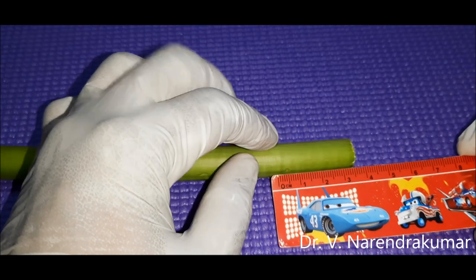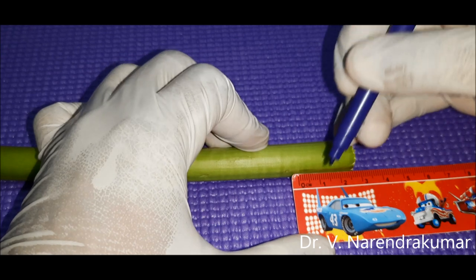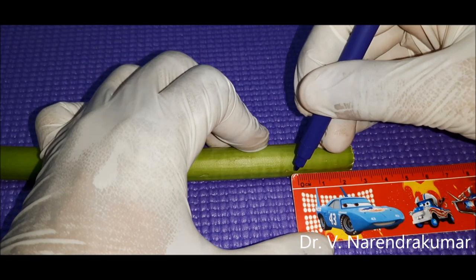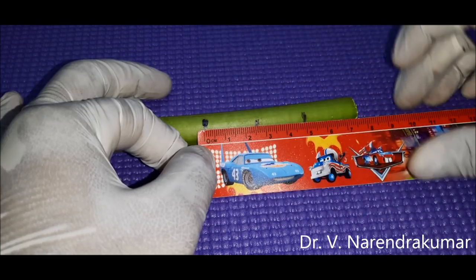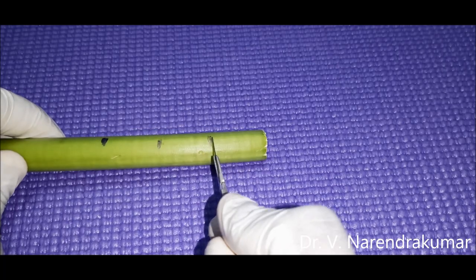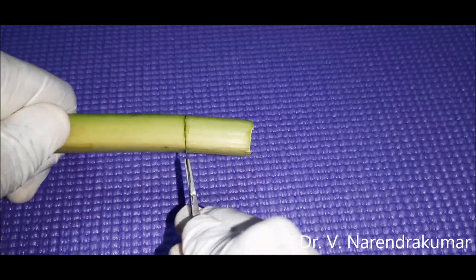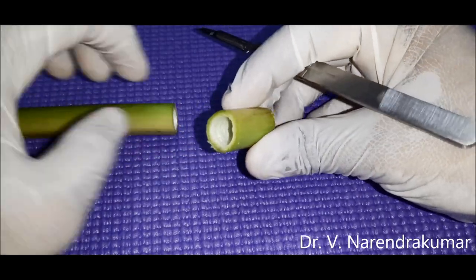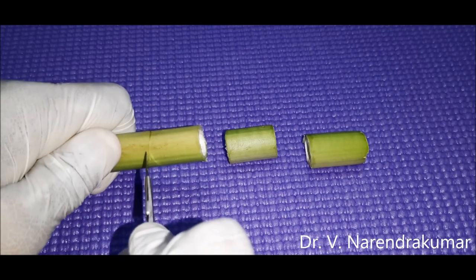Have the petiole ready. Our external auditory canal is approximately 24 mm, so just mark it like this. You can mark multiple and cut into small pieces with a fine ending. Here the external auditory canal is ready. You can make multiple pieces as well.